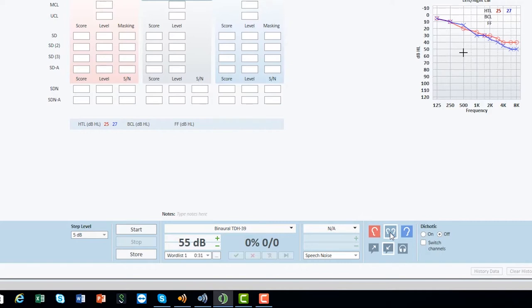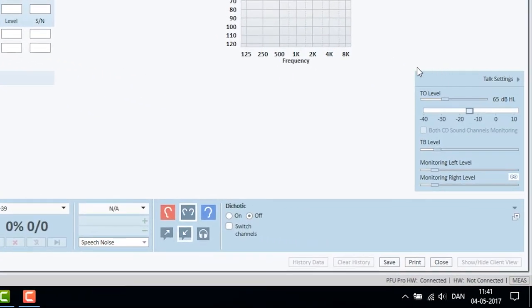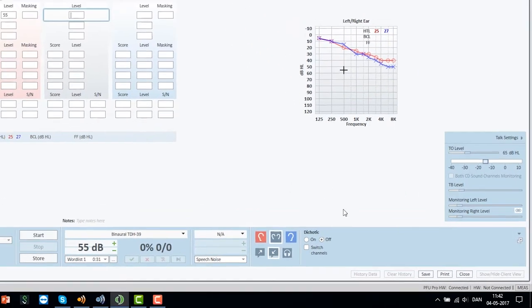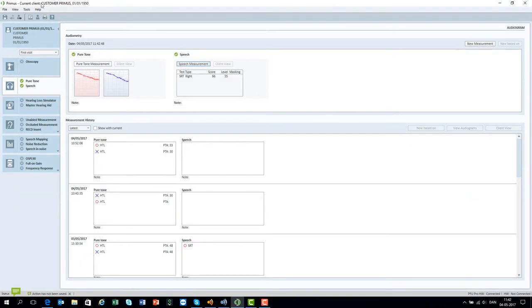Talk back is always enabled by default so it is possible to hear the client that is being tested. Level of talk back, talk over and monitoring are found in the talk settings.